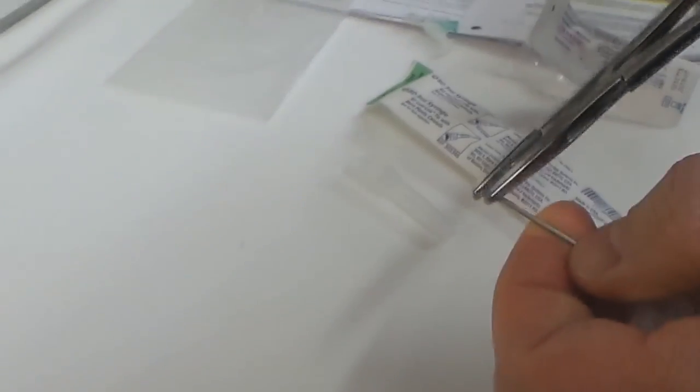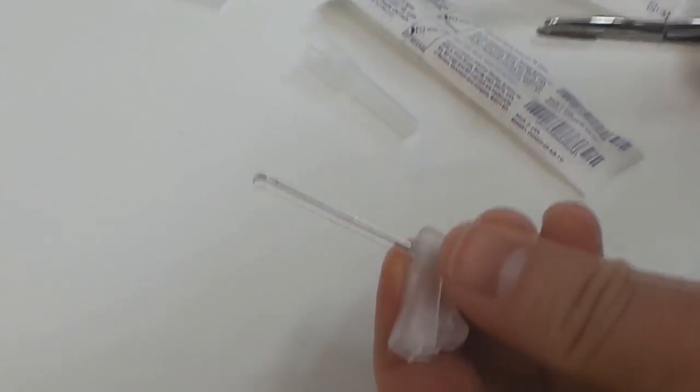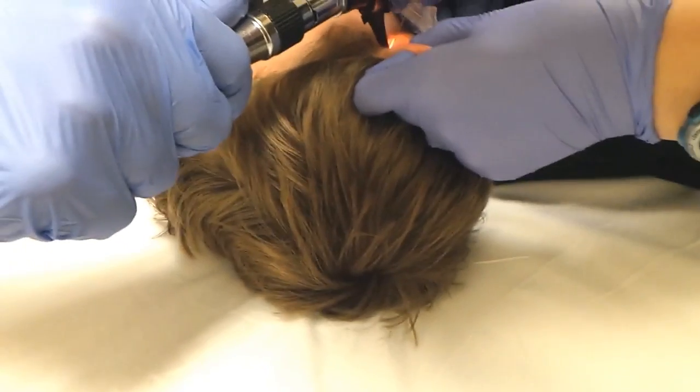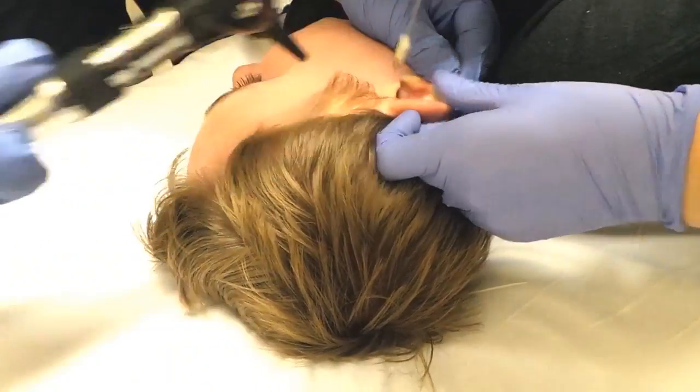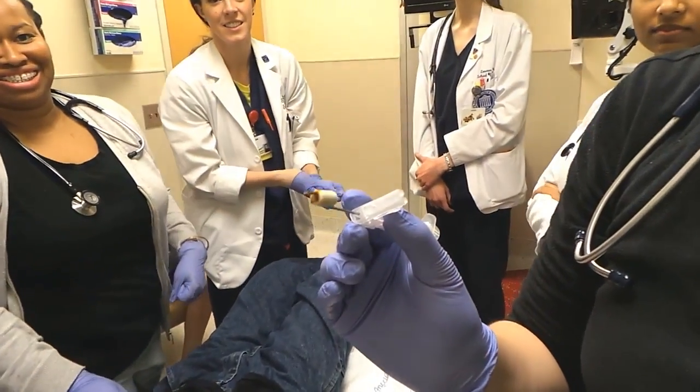You can go even a little bit more. Yeah, that looks like it'll work. Can you see it? Hold still for me. Got it. Stop. There we go. Let's see it. Now that was very smooth.